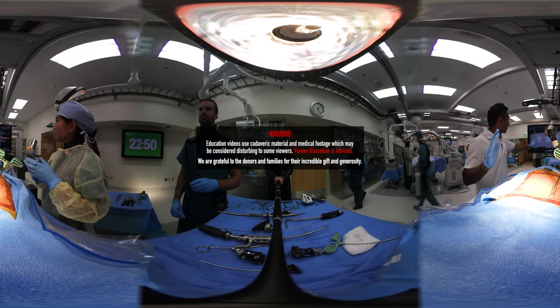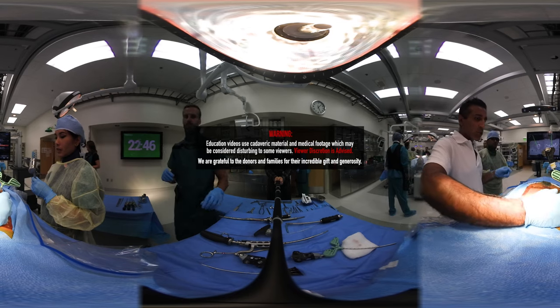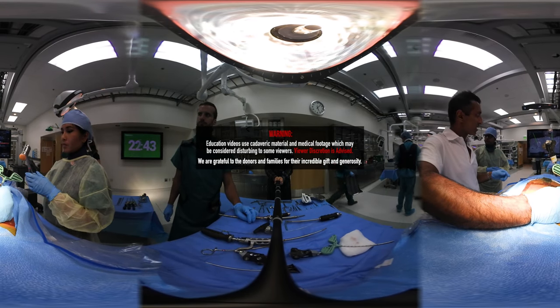You're here. Again, we're going to let go. Let's see if we let go. We're middle, middle, right? Maybe aiming a little too far down. So in our last few millimeters, we're just going to angle just like that.